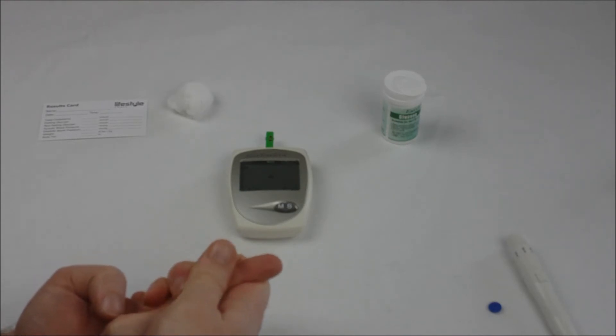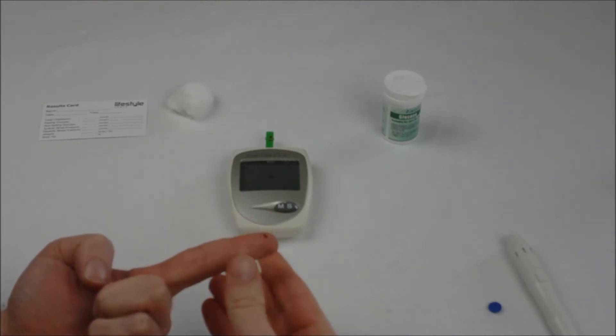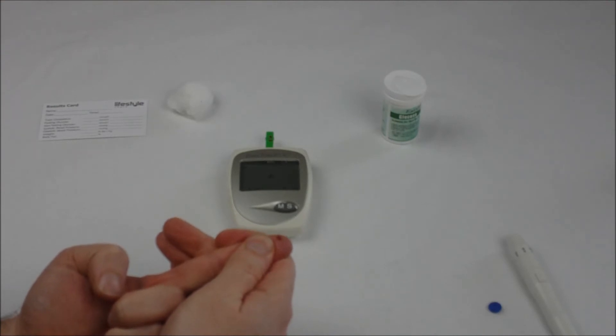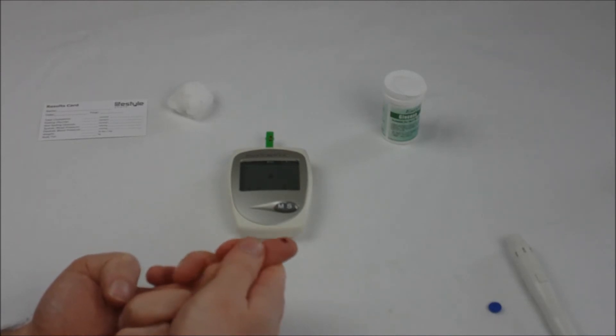Put your lancing device to one side and allow your pin prick to bleed. Don't squeeze your finger too much as this will create a diluting effect and reduce your blood glucose level. Allow it to bleed as naturally as possible.